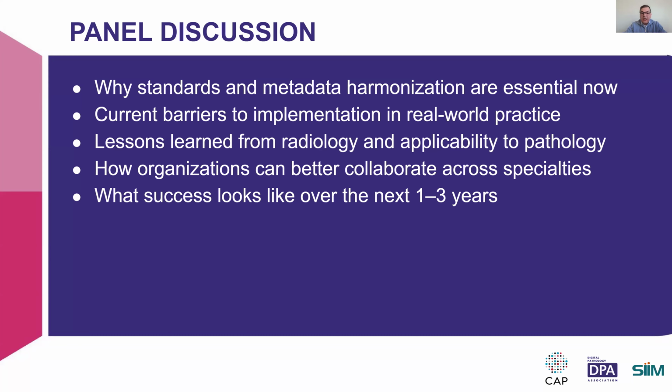The other barrier that I also think of is vendor ecosystem immaturity. When we start looking for scanner vendors, unlike radiology, where DICOM compliance has been the norm for decades, many digital pathology vendors still, till today, provide it only as an option. I haven't seen any single scanner vendor provide DICOM-only or DICOM-native output. This is what I'm really looking for.